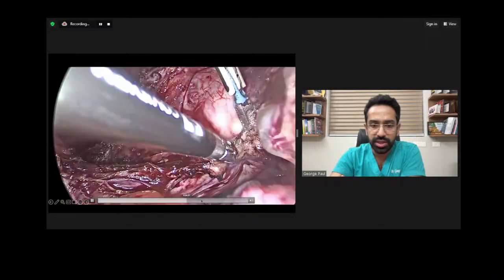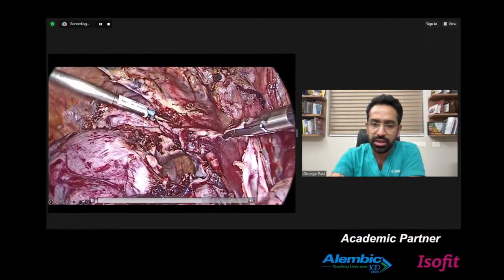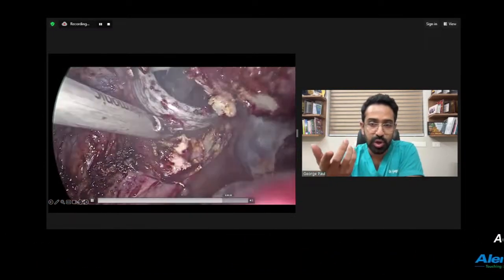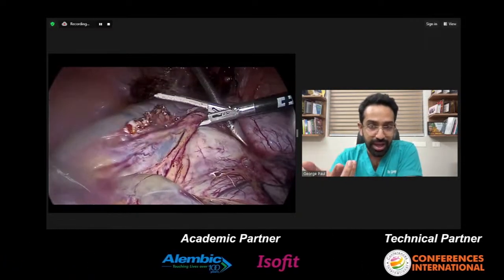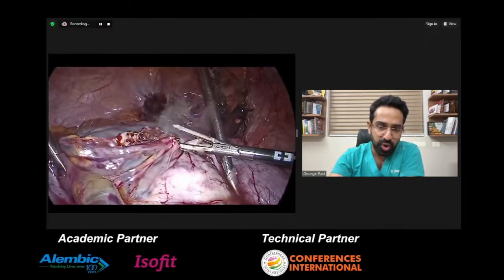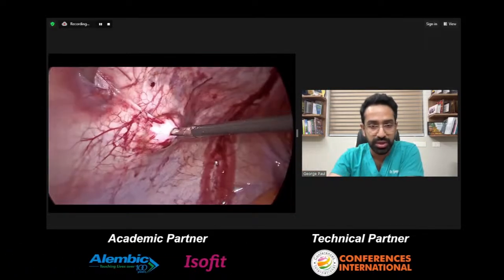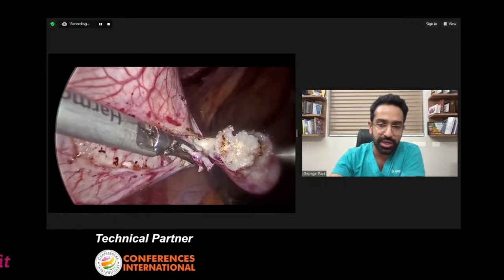So myomectomy was done. Since we were doing this along with the hysterectomy, the specimens were taken through the vagina. Now a lot of people are questioning vaginal morcellation as well, whether we should do that within a bag or not is also a big question nowadays. So probably with situations of parasitic myomas following vaginal morcellation also, I think eventually we might end up doing that in a bag as well.